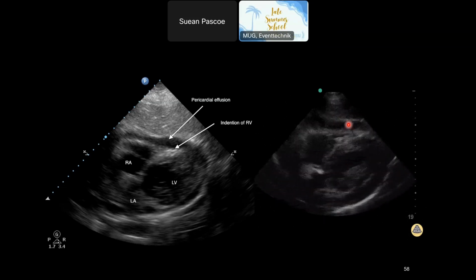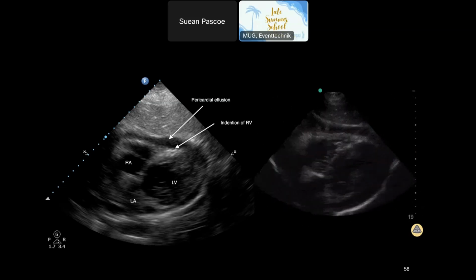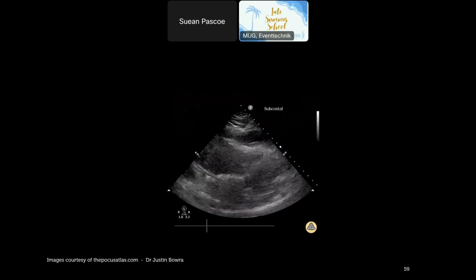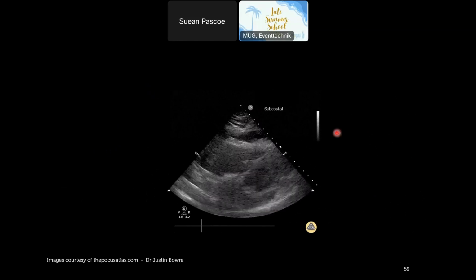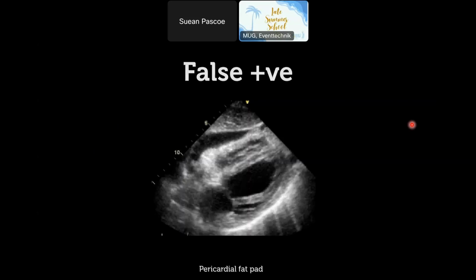And if the pericardium stretches slowly over time, it can get bigger and can compensate. Whereas in a traumatic situation, if that fluid in that pericardial sac is collecting really quickly, you'll tip over into a tamponade situation much more quickly. Here we can see a tamponade situation. We've got the free fluid, and you can see this free wall of the right ventricle just collapsing in on itself. That's when we are looking at a tamponade situation.